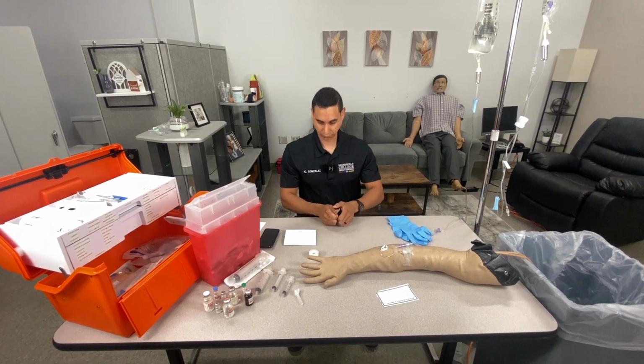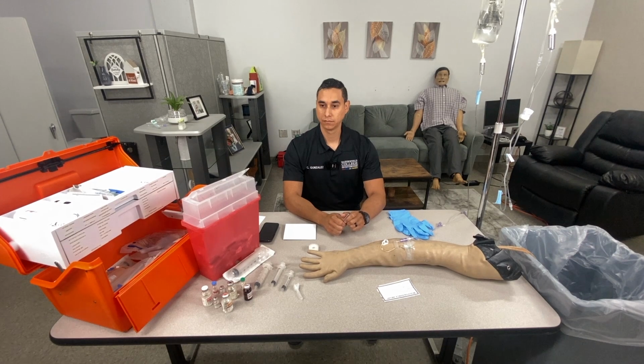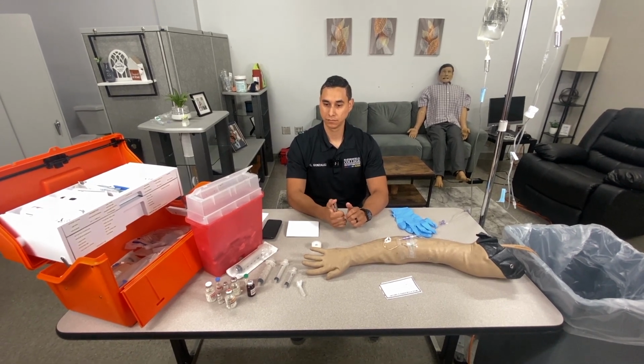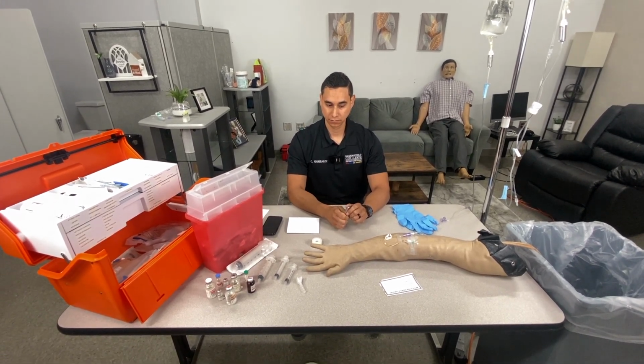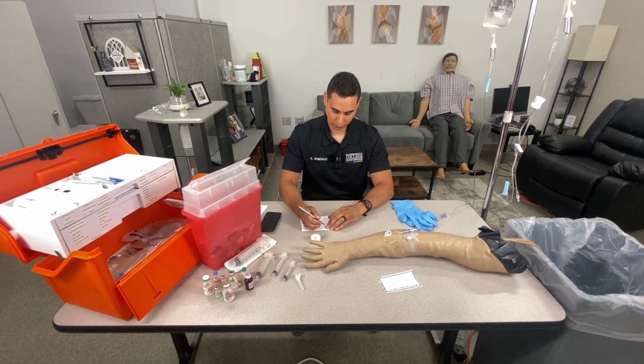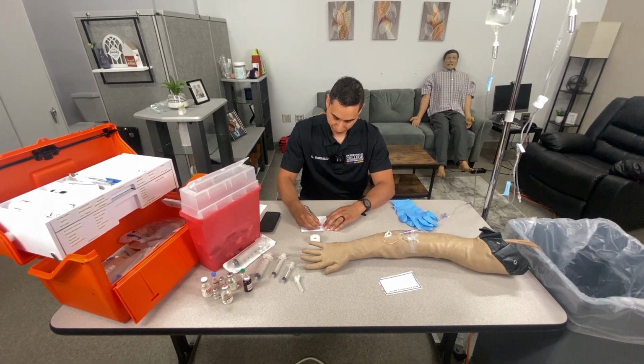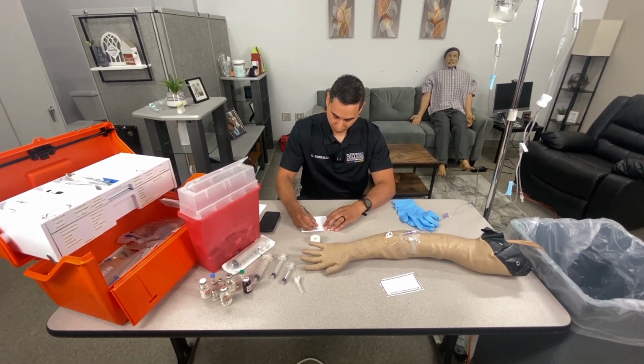This is the medication drip station. You are on scene of a cardiac arrest patient in which the patient has achieved spontaneous circulation. The patient remains hypotensive after being given a 250 ml bolus. The base hospital orders 5 micrograms per kilogram per minute of dopamine. Your patient weighs 100 kilograms. You may begin.